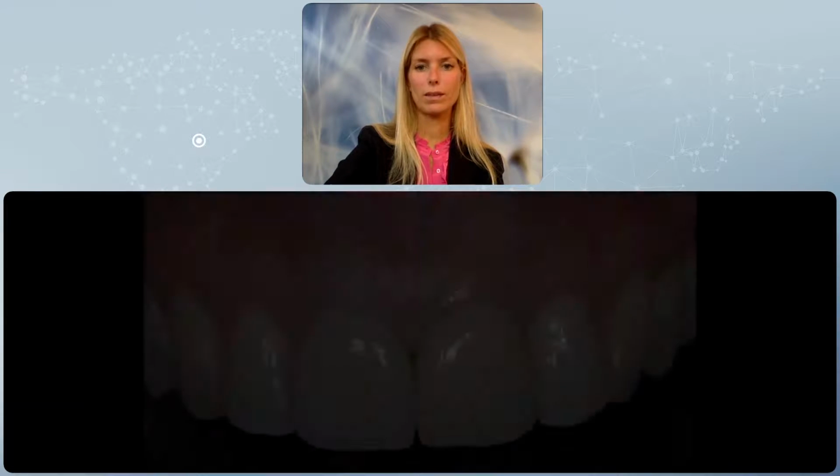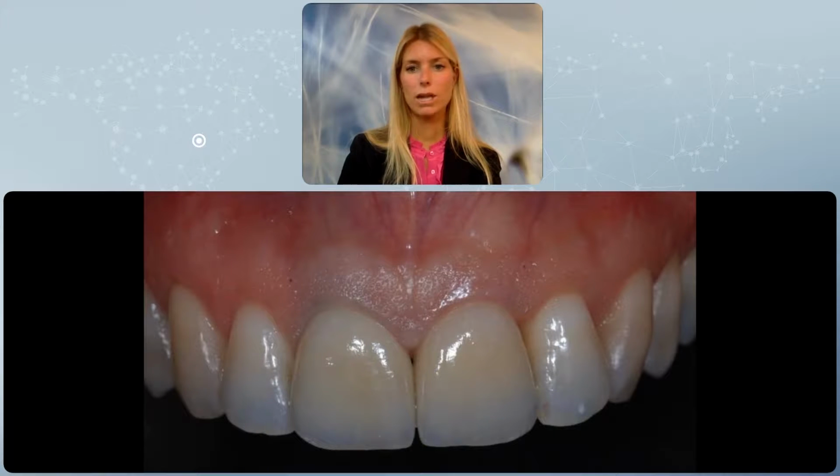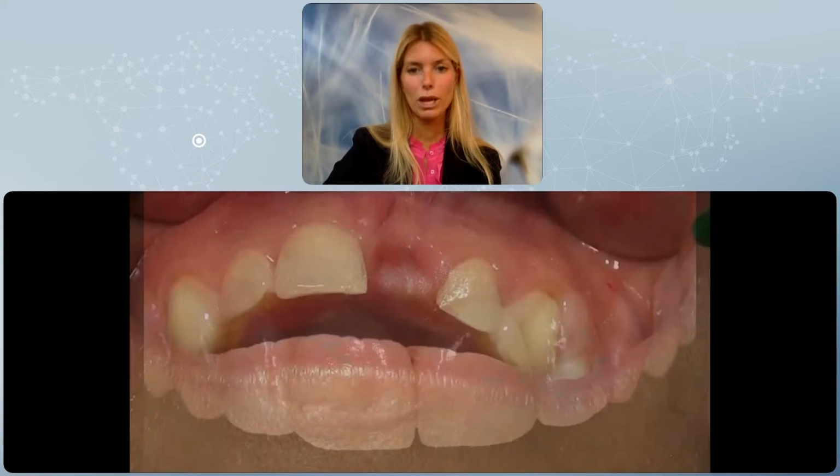And at the end of the day, the patient was finalized with a very natural looking smile, and in fact the natural tooth on her right hand side shows a small grey shadow due to the post and core that was used, but of course this is just a purely cosmetic defect which wasn't bothering the patient at all. The implant itself is looking very natural.